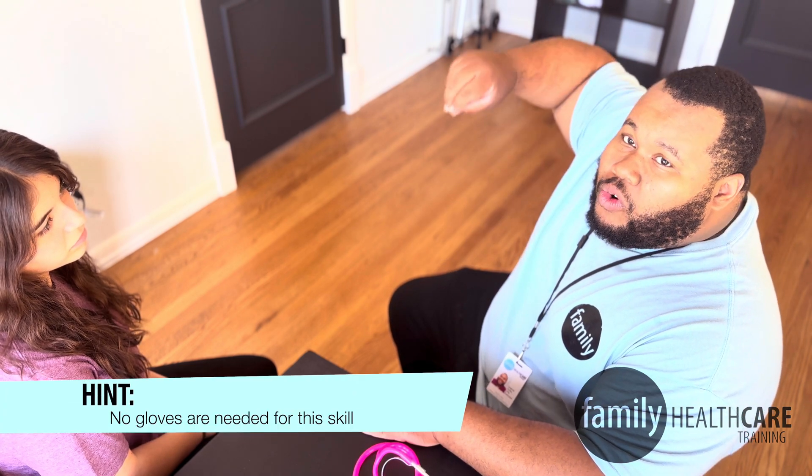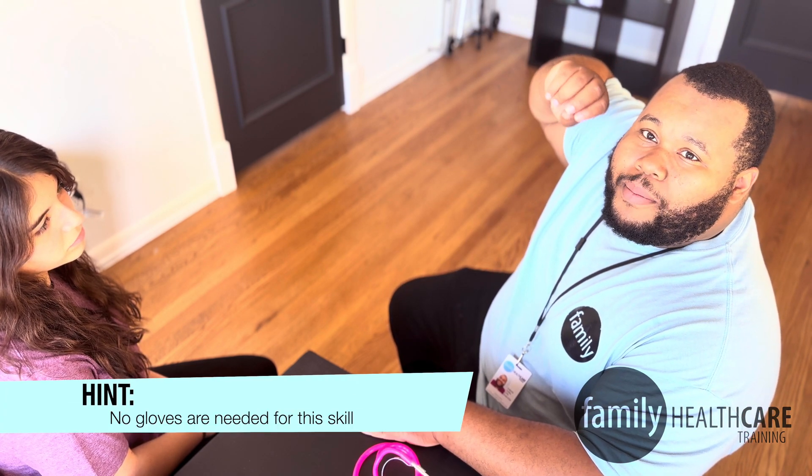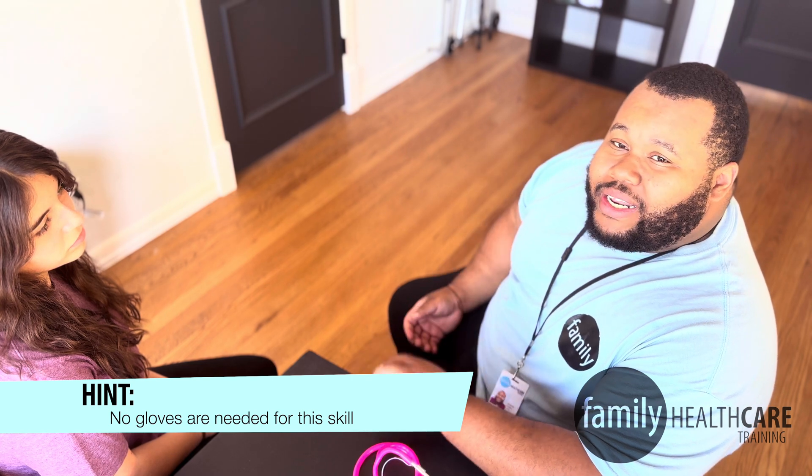When it comes to vital signs, taking a temperature is our only gloved vital sign, so we do not need gloves for this skill. I'm going to wash my hands and not put on gloves.